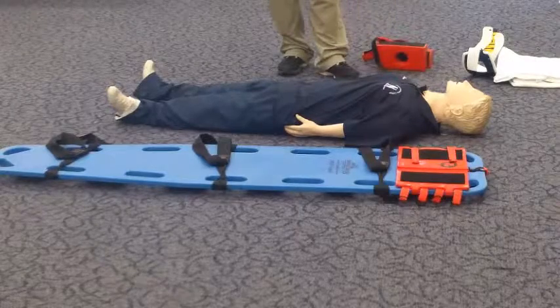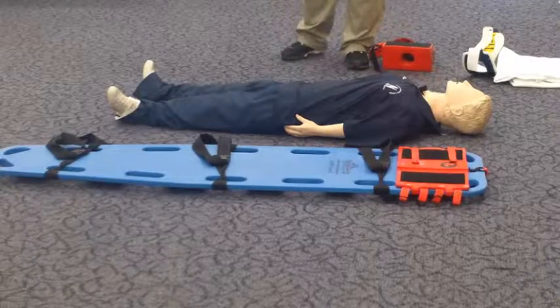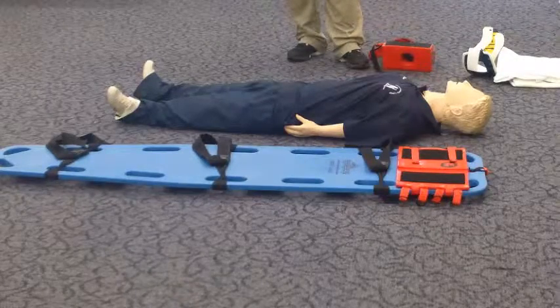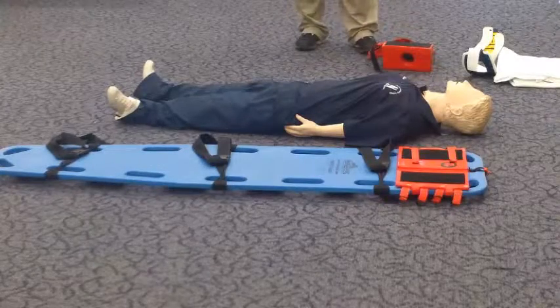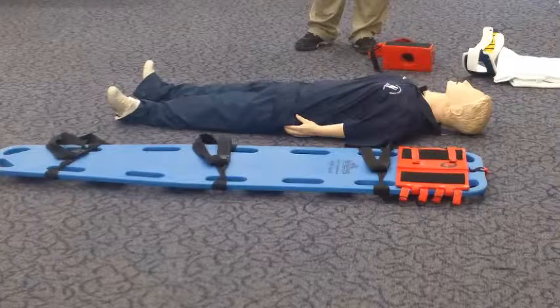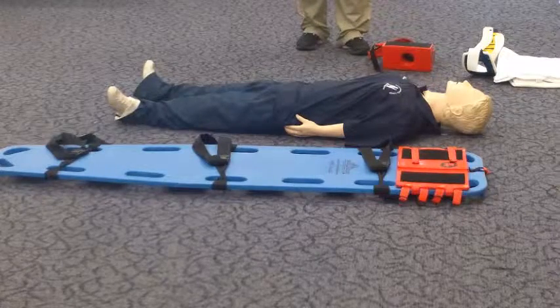Welcome to the Spinal Immobilization Supine Station. This skill is designed to evaluate your ability to provide spinal immobilization to a supine patient using a long spine immobilization device. You arrive on the scene with an EMT assistant. The EMT assistant has completed the scene survey as well as the primary assessment, and no critical condition requiring any intervention was found. For the purpose of this evaluation, the simulated patient's vital signs remain stable. You are required to treat the specific isolated problem of a suspected unstable spine using a long spine immobilization device.